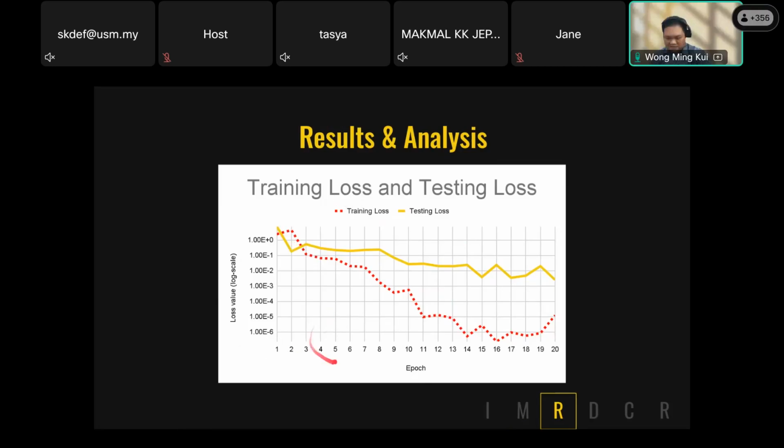We can see that the loss is reducing, but after cycle 16, it seems like the loss is going up. I stopped here, but if I proceeded, probably the loss would go up, so the accuracy is reduced after this.